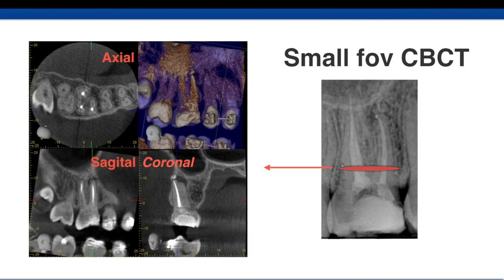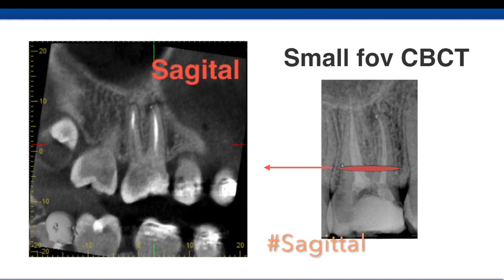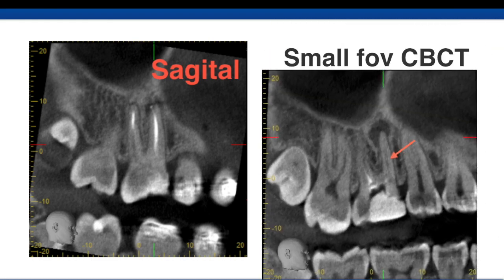Now looking at the sagittal view, I can see the MB1 which is obturated, along with some sealer extrusion. In another section of the same sagittal view, the MB2 canal is visible — look at the size of that lesion compared to the first section. This more palatal section clearly shows a large lesion at the apex. These points are more than sufficient for me to confirm there is an MB2 that I need to find, shape, disinfect, and obturate.